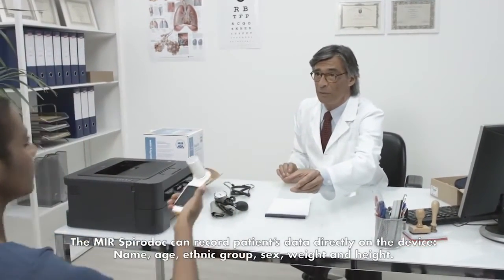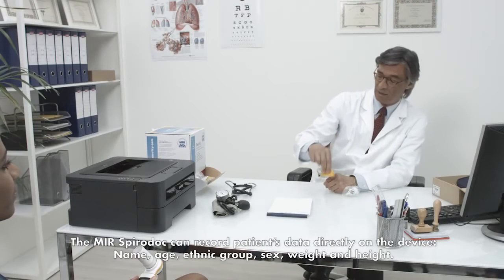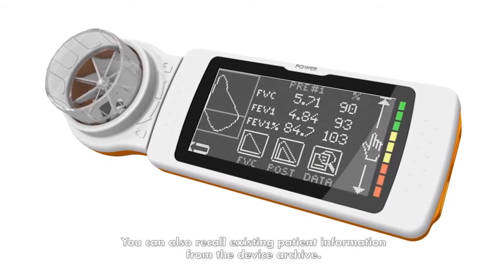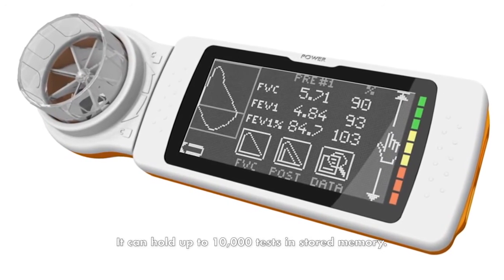The MIR SpiroDoc can record patient data directly on the device — name, age, ethnic group, sex, weight, and height. You can also recall existing patient information from the device archive. It can hold up to 10,000 tests in stored memory.